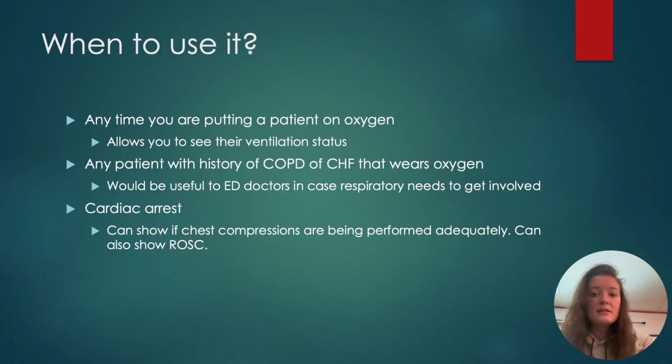When to use it, I would do it anytime you're putting a patient on oxygen, anyone with difficulty breathing, especially if you have a patient with COPD, CHF that wears oxygen. It's not going to hurt to just go ahead and put them on end-tidal CO2, especially if they might have fluid on their lungs, even though their chief complaint is something else.